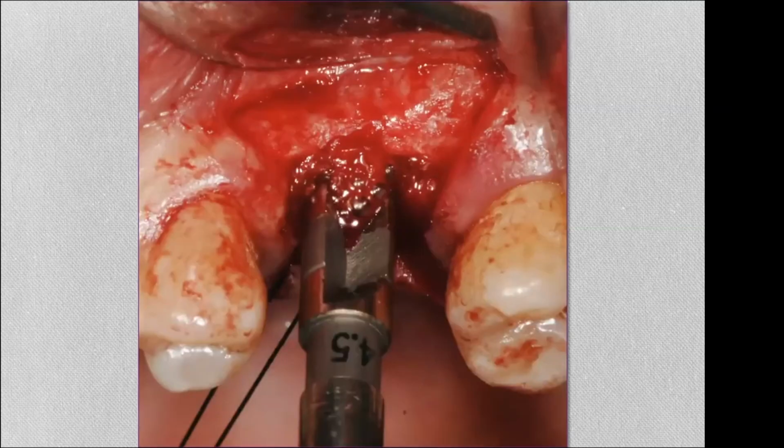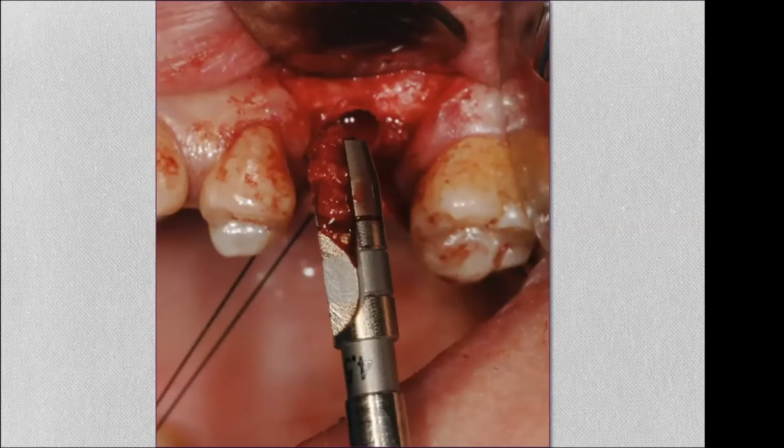So what I did is went to hand reamers and reamed to only the palatal part. So we start with this cutting edge on the distal buccal, rotate roughly a half or 2/3 of a turn, stop and pull out, okay? Like so, collect all of that bone. All of this is excellent bone that we could use in the graft. We can use it over the implant, and quite sometimes, a few times, we get enough bone that we do not need any bone graft. We'll just use the autogenous bone from the osteotomy.